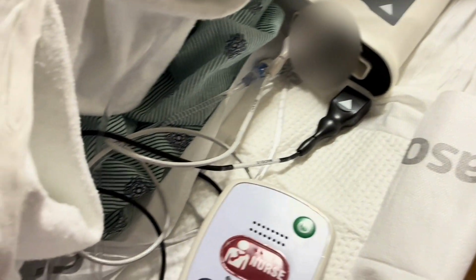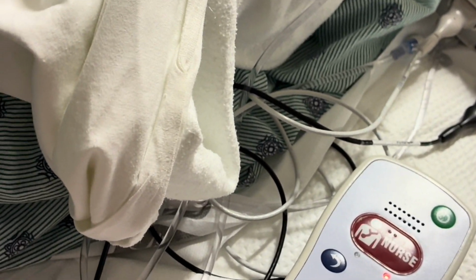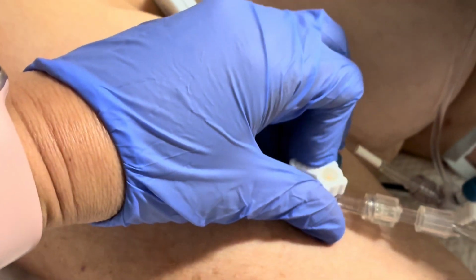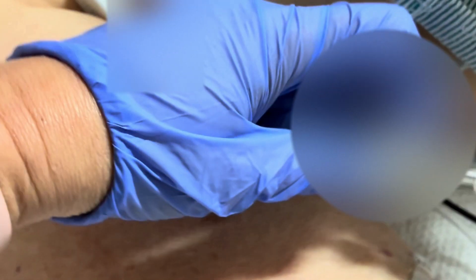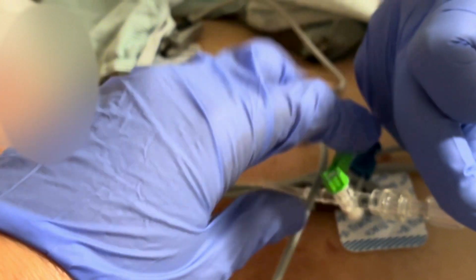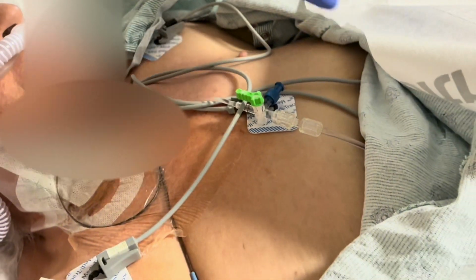All right, so that's already off. And as Asha is doing this, we're gonna turn this off towards the patient. So that's off. This is off. And this one we're also gonna turn off. Now nothing is going towards the patient.